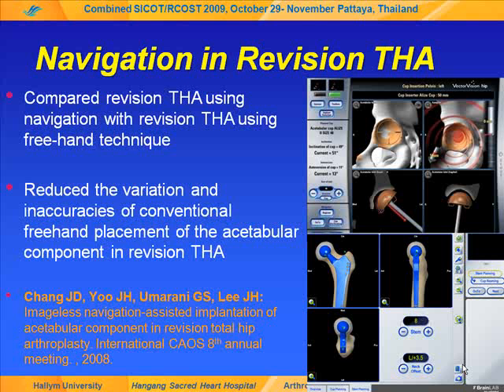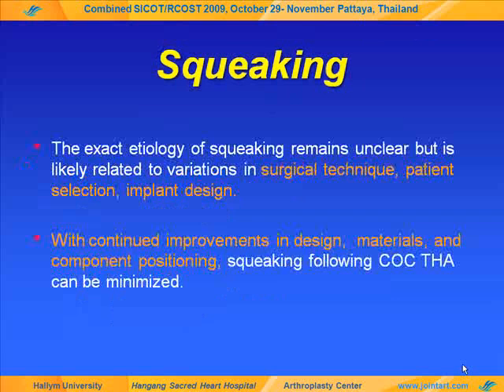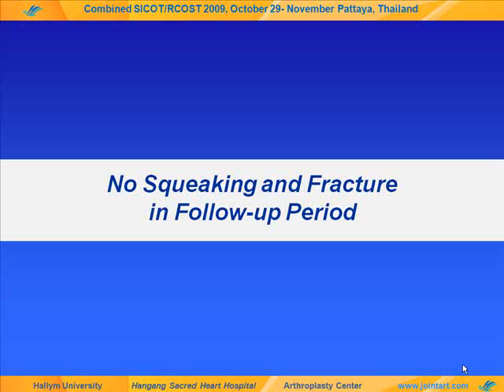Squeaking is an important issue and the incidence has been variably reported. The incidence in Korea is low and the proposed cause remains elusive and multifactorial. However, it is likely related to variations in surgical technique, patient selection, and implant design. With continued improvement in design, material, and component positioning, squeaking following ceramic on ceramic total arthroplasty can be minimized. In this study, there was no squeaking and no fracture during the follow-up period.